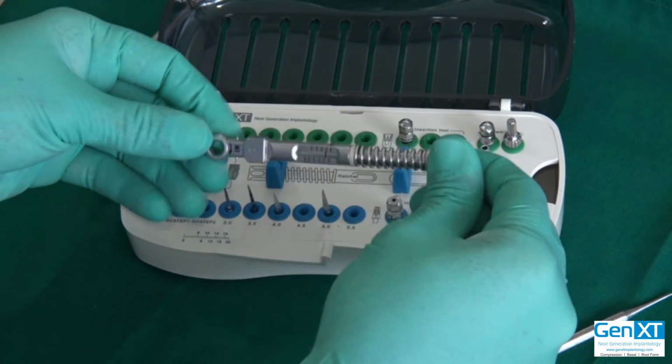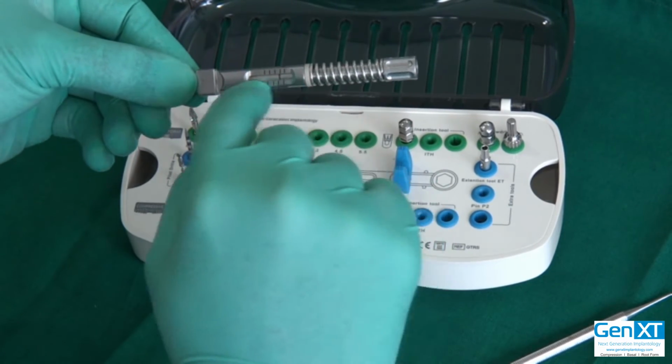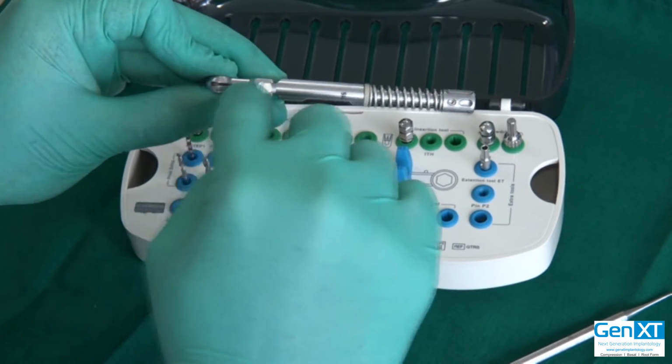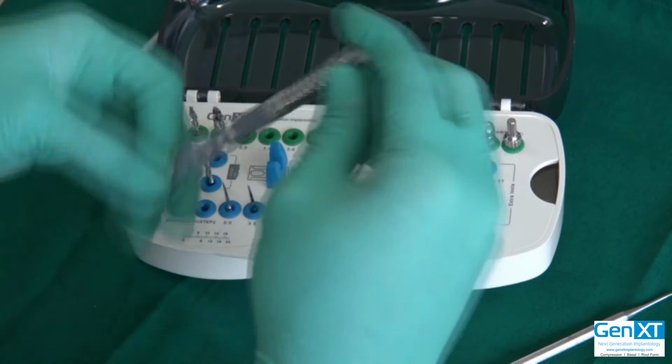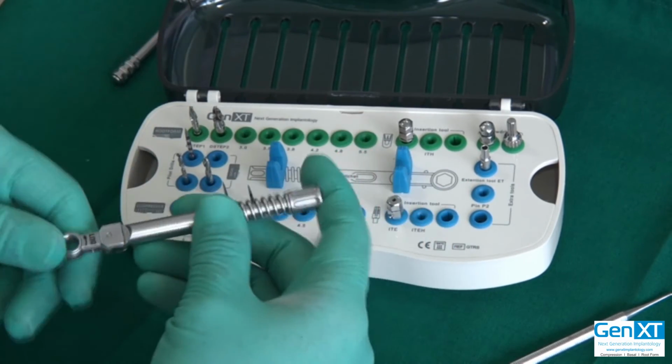Similarly, for maintenance of the torque ratchet, you have to make sure you oil the spring, you oil the area of the graduation, and also you oil this slot over here. Just to make sure everything stays smooth and as calibrated as possible.